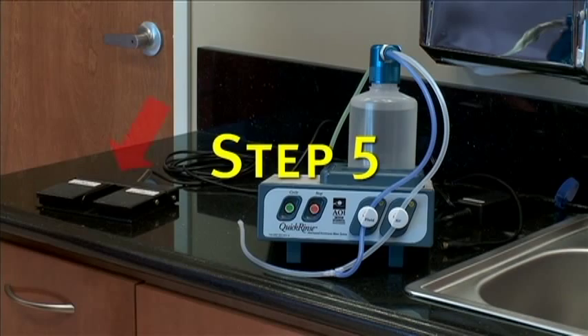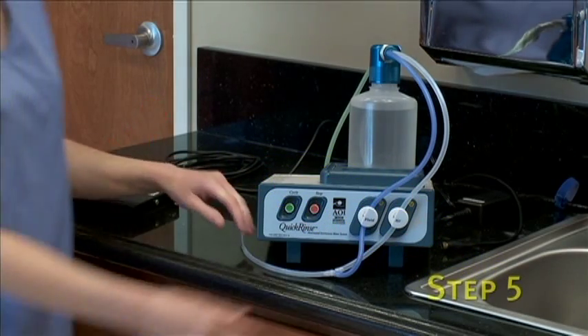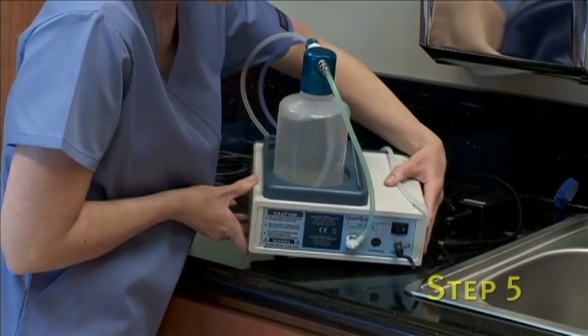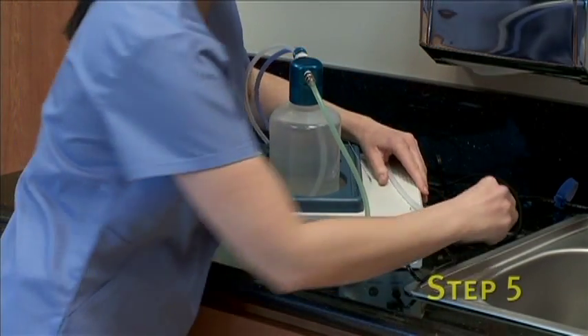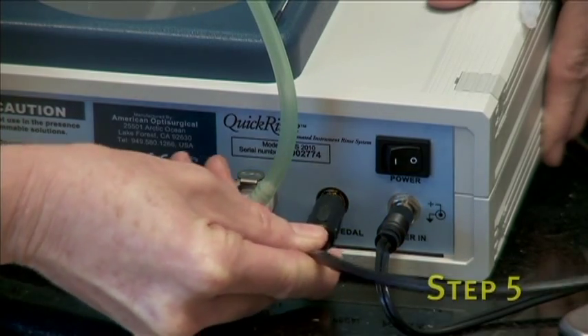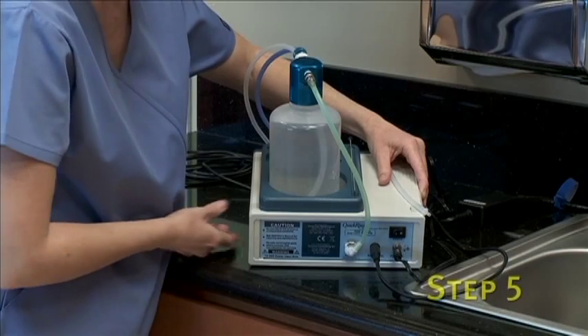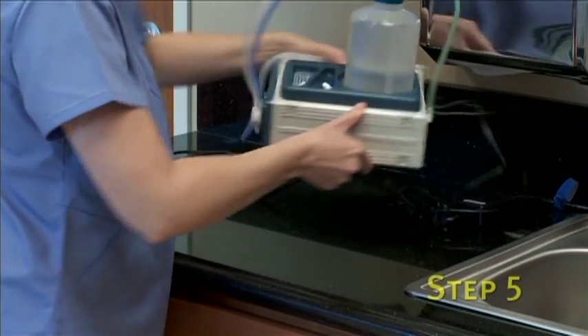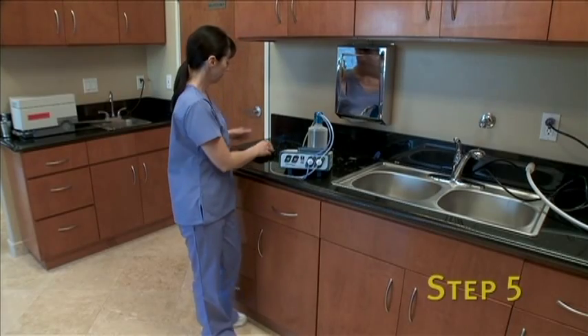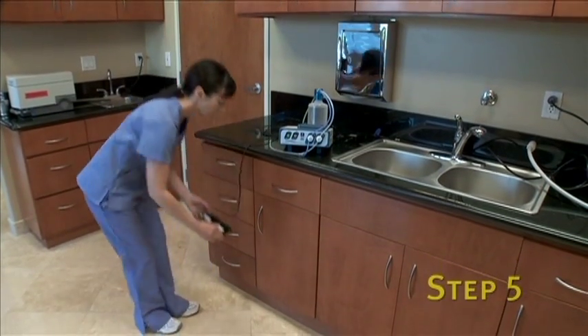Step 5 is for connection of the optional foot pedal. If you did not purchase the optional foot pedal, you may skip to Step 6. If you have purchased the optional foot pedal, take the foot pedal connector and plug it into the back of the Quick Rinse into the female connector labeled foot pedal. After connecting, place the foot pedal on the floor in a location which is convenient for use.